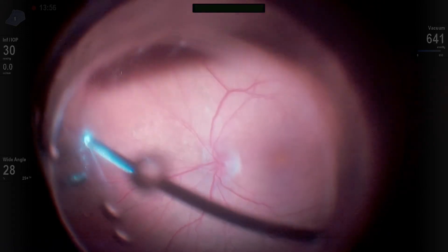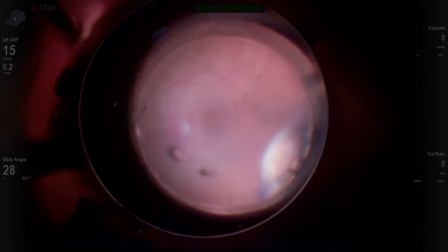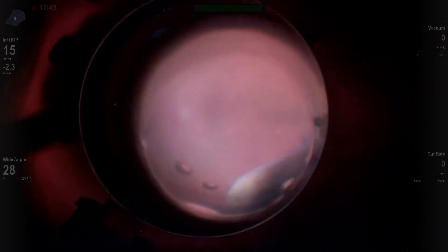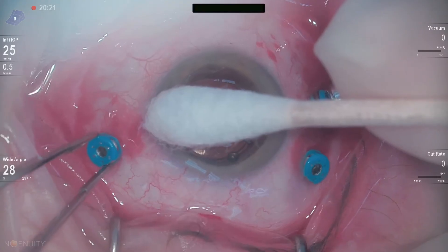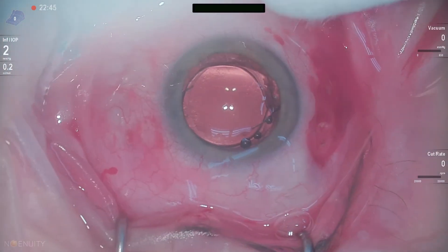The final step, as always, when you induce a PVD or do a vitrectomy in general, it's always a great idea to do a depressed examination afterwards. You'd be surprised how many times you find retinal breaks or tears. And thanks to 25-gauge small-gauge technology, the wounds seal up beautifully.